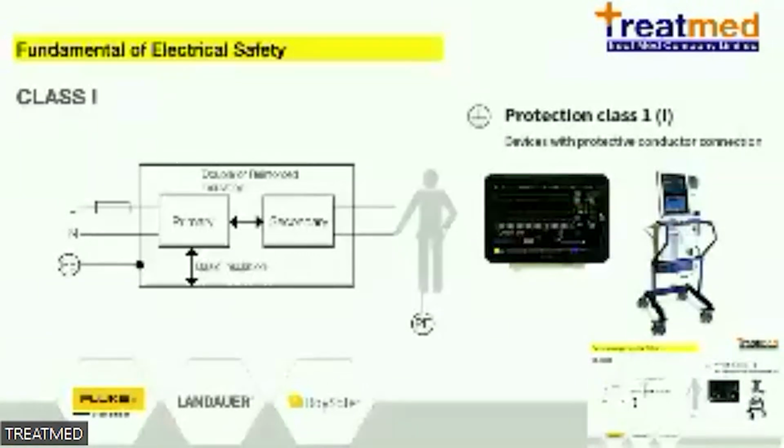Okay, this is the theory of the IEC 60601. For the first part, we must know the class of the medical device and the type of the medical device. For the class of medical device in Thailand, mostly we make two classes of the medical device.